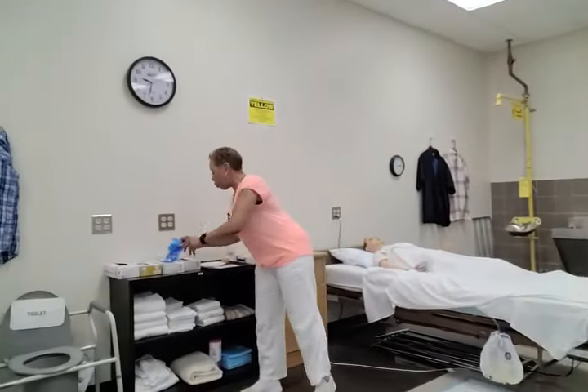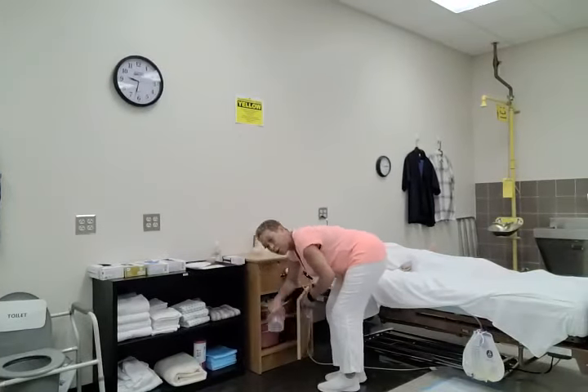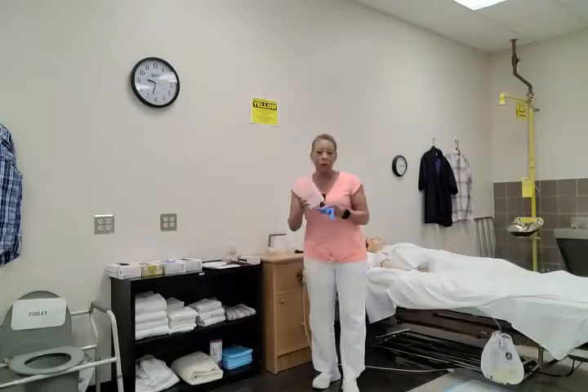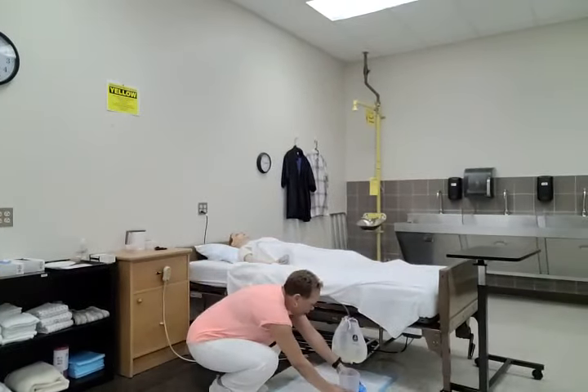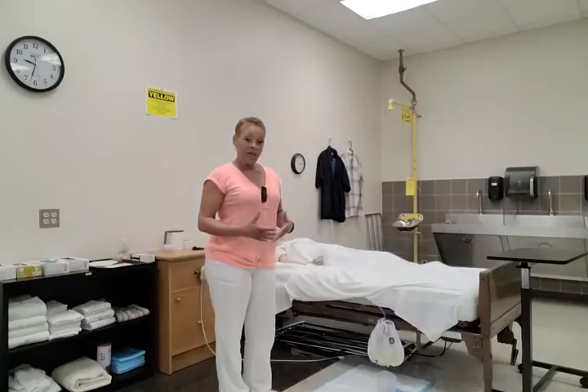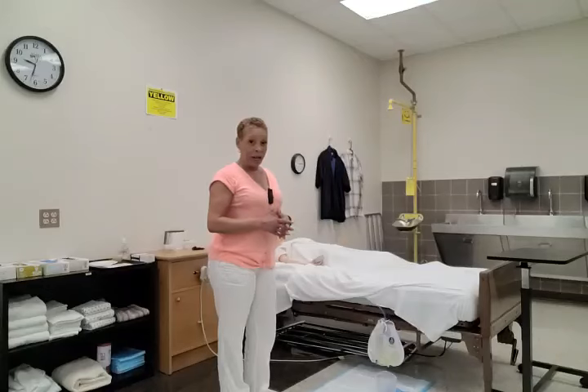Then I'm going to collect one pair of gloves and a measuring container or graduate. I'm going to place my supply items on top of the clean barrier. For this skill you can either squat or kneel. If you kneel, make sure you place your knees on the clean barrier.